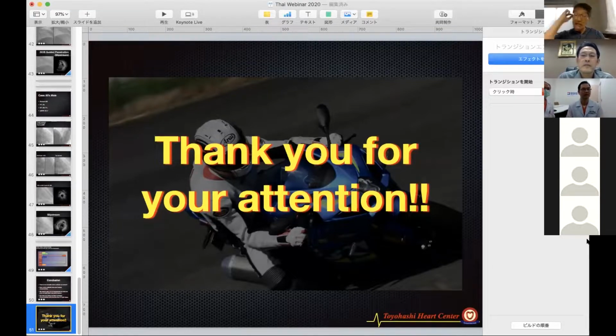But in some cases, with counterclockwise rotation, the Corsair hardly advances to the distance. In such a situation, I change the direction of the rotation from counterclockwise to clockwise rotation. So it depends on the case.